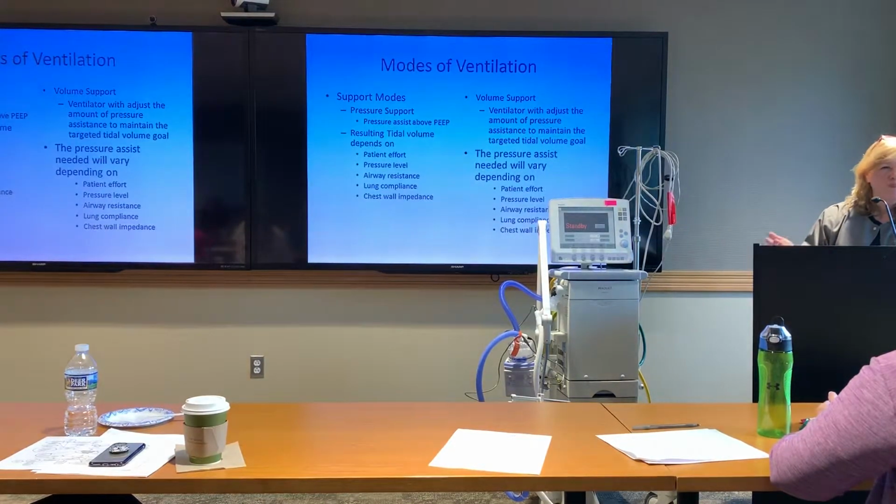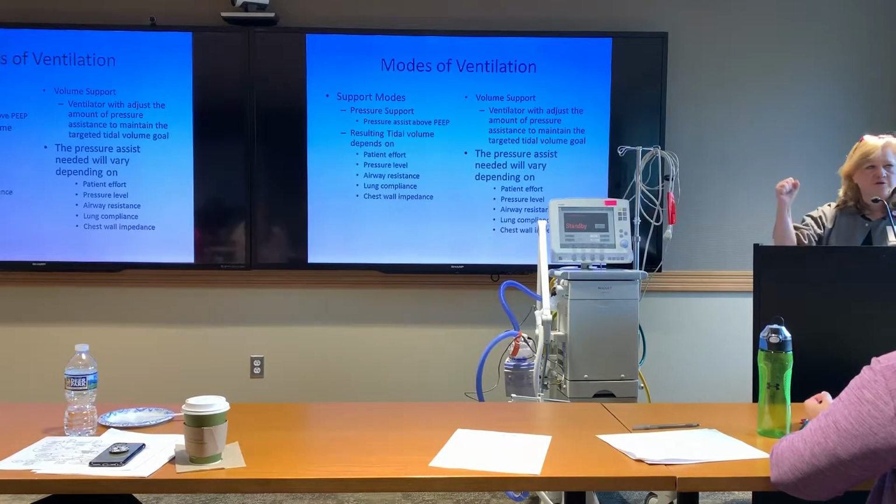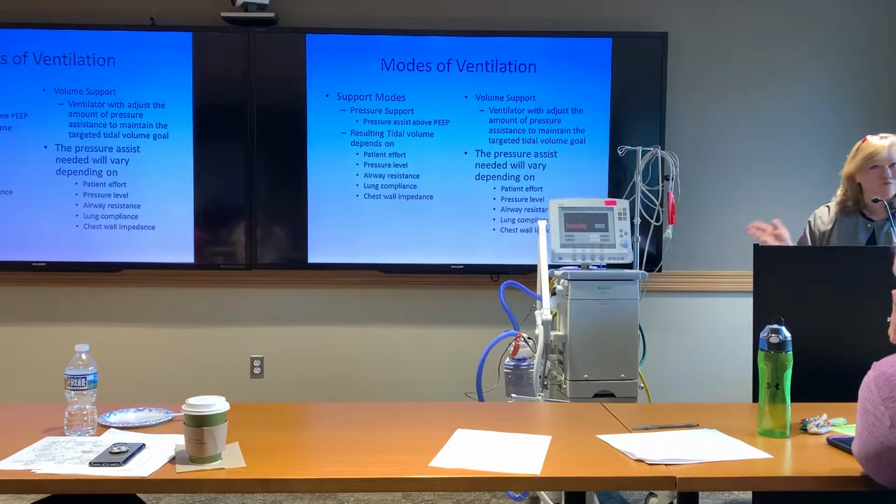so SIMV really doesn't have a role anymore. Now, some physicians, none of them here, firmly believe in it. So if you go to another institution, I can't help what they practice. If they use SIMV all the time, I'm sorry.